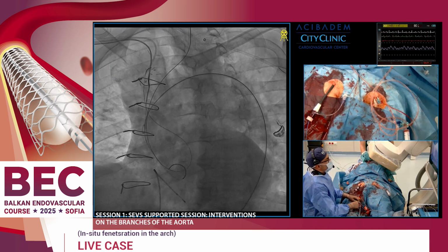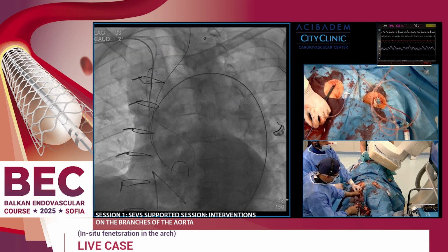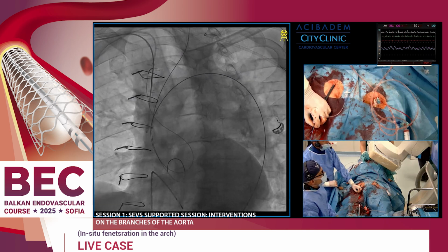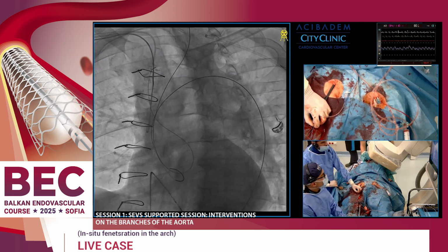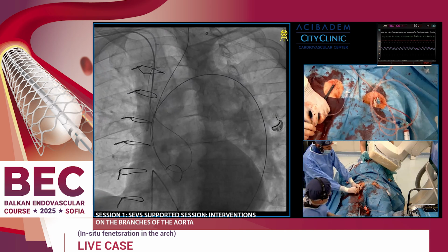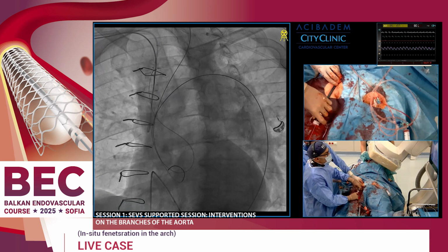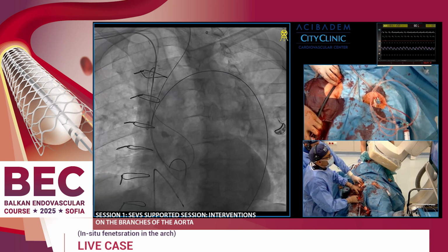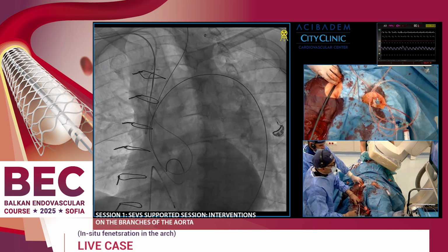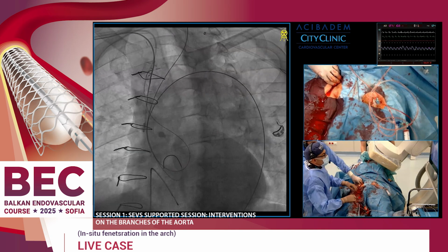Like that. We are probably even, yeah, we are there. Because several minutes ago, the wire entered the left ventricle. And in fact, like we say, the left ventricle is the extreme version of the true lumen. So everything is starting from the left ventricle. It means we are definitely in the true lumen.